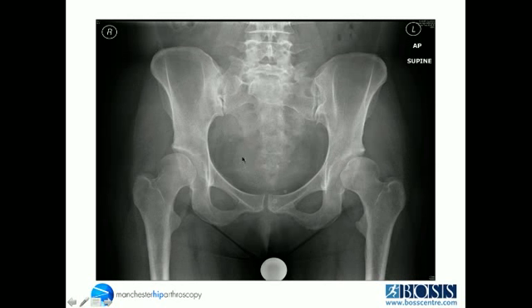X-rays are also useful looking for very abnormal hips. So this is a patient with hip dysplasia where the acetabulum doesn't fully cover the entire head. And this will have been present since birth, but probably not severe enough to show up during early childhood. But the problem with these patients is that the whole weight-bearing portion of the hip is over this small area. And no matter what you do arthroscopically, they actually need a more fundamental treatment, and we'll talk about that later on.